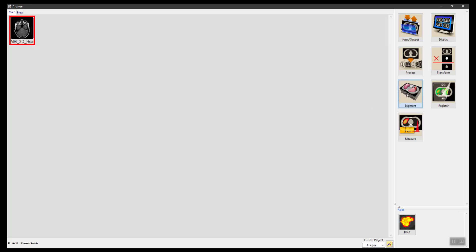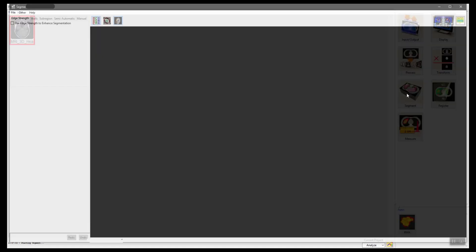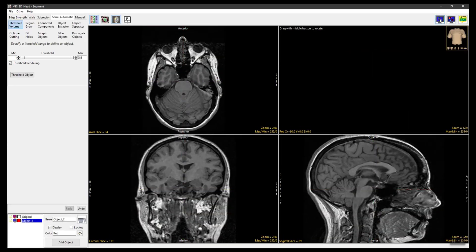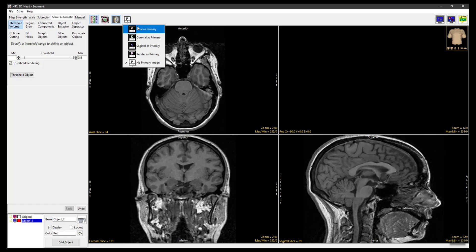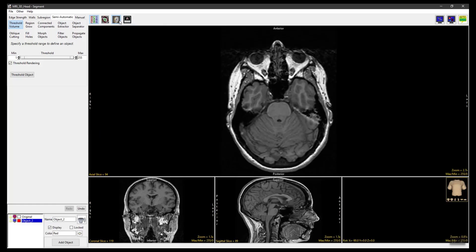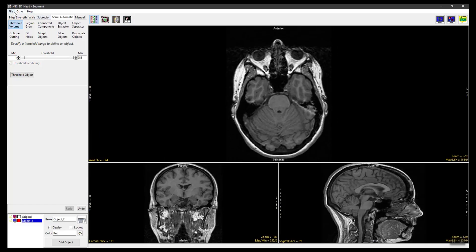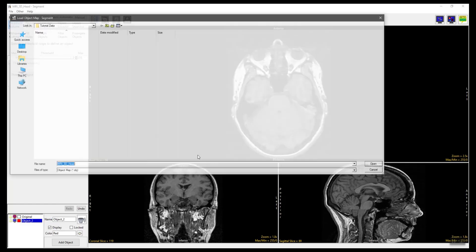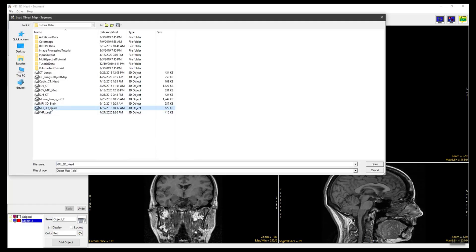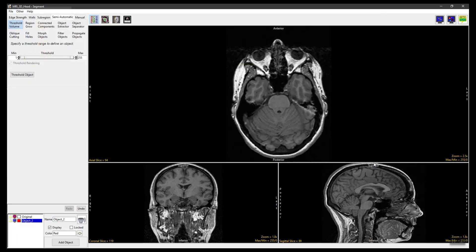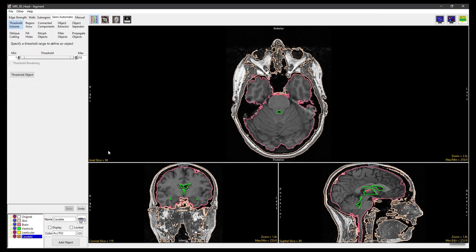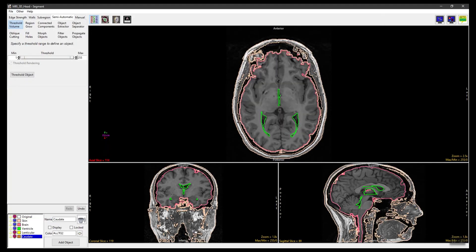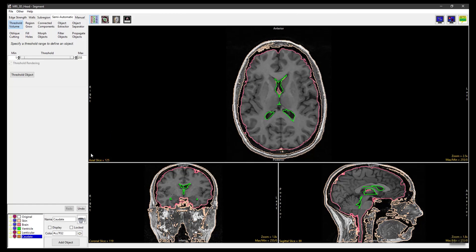To start, select the dataset and open Segment. In the Display Controls layout, set Axial as Primary and toggle off the render window. Select File Load Object Maps and load mri3dhead.obj, the object map included in the Analyze tutorial data and associated with this dataset. Using the Slice tool, navigate to an axial slice that displays the ventricles.